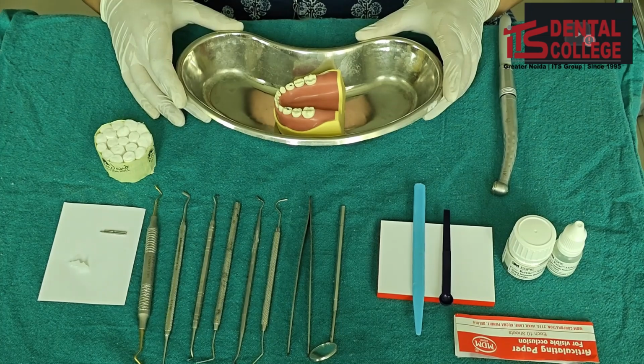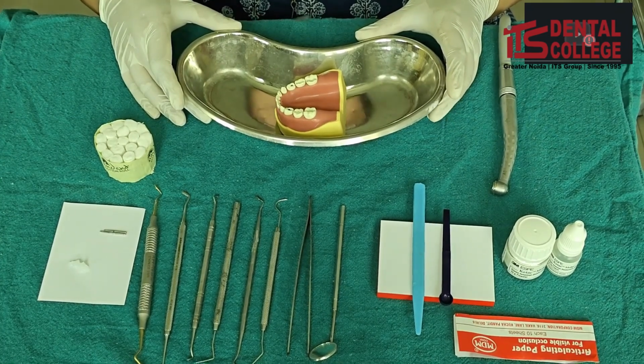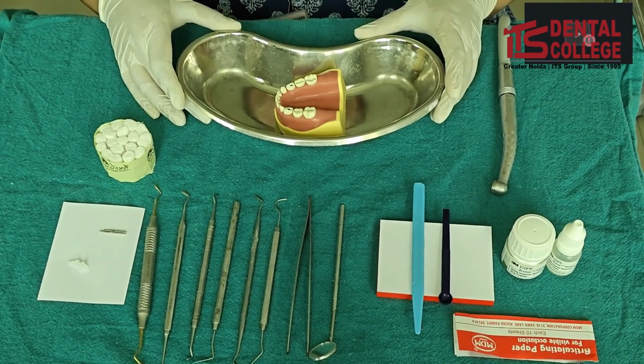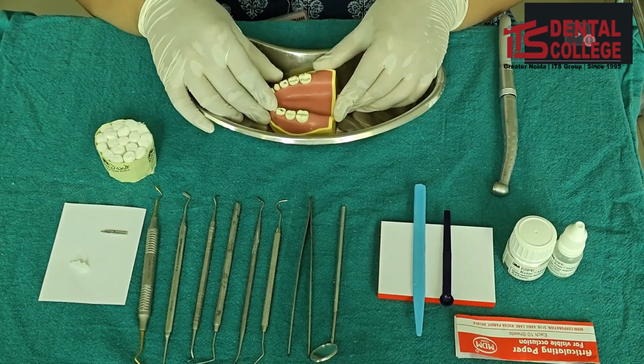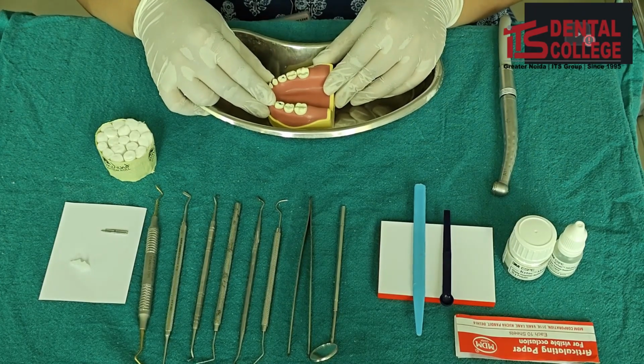It is so called because the powder contains aluminosilicate glass and the liquid contains an ionomer of polyacrylic acid. Glass ionomer cement is especially advantageous in primary teeth because it chemically bonds to the tooth and also releases fluoride.